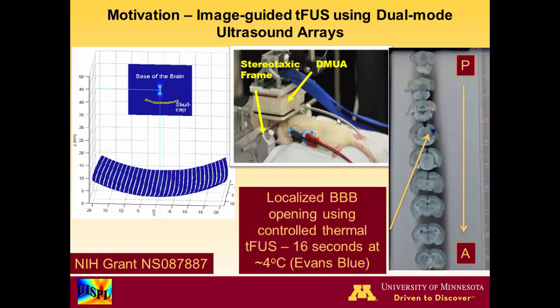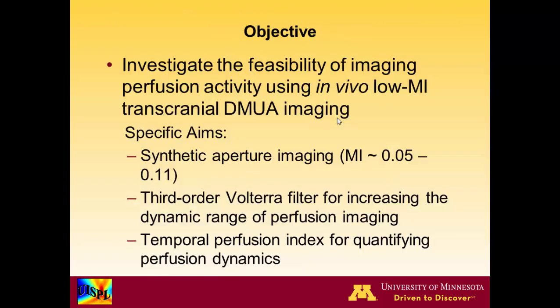This figure is the blue dye injection result from the blood-brain barrier opening experiment we did in late September. And as you could see here, we were able to use the thermal effect to open the blood-brain barrier. All this promising work gives us the feasibility for the treatment. Still, we need to use the blood perfusion to provide the guidance.